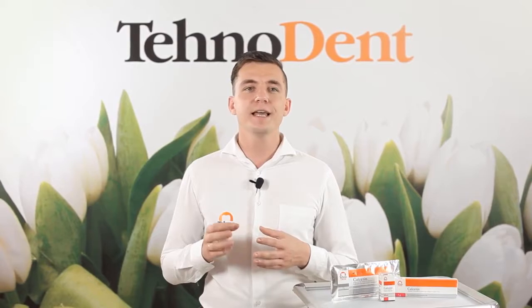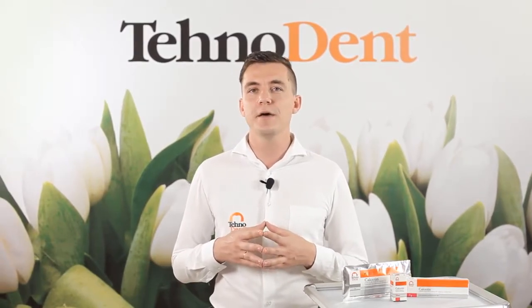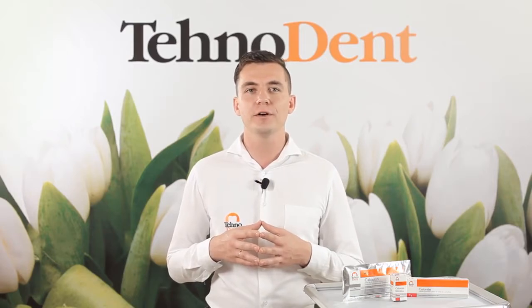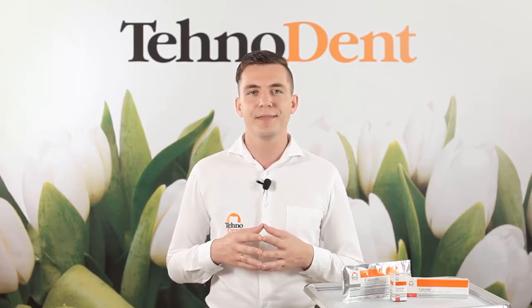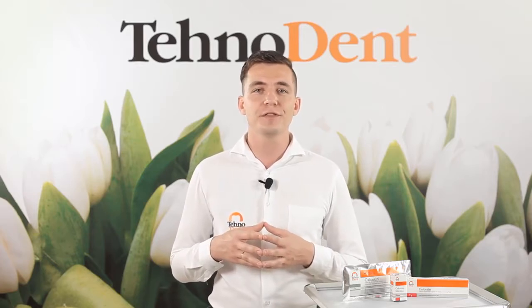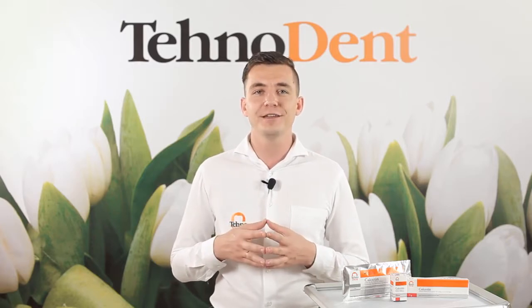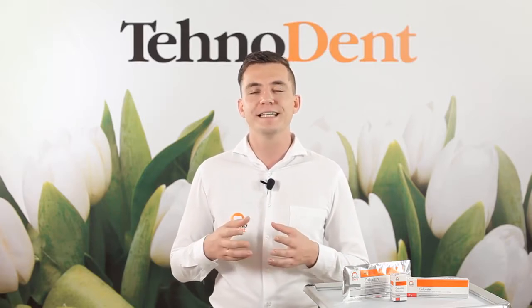Paste should be isolated with a dry cotton swab, and the tooth is covered with a temporary filling cement for a period of 7–10 days. Depending on the result, continue treatment with a change of the material to a fresh portion or apply the final filling of the root canal with the sealer.